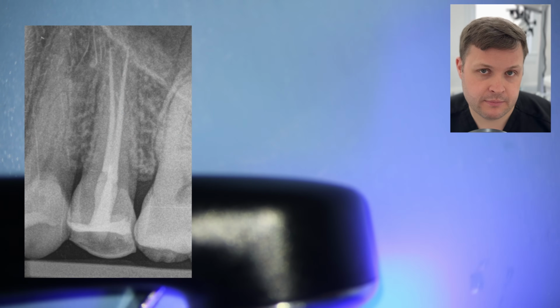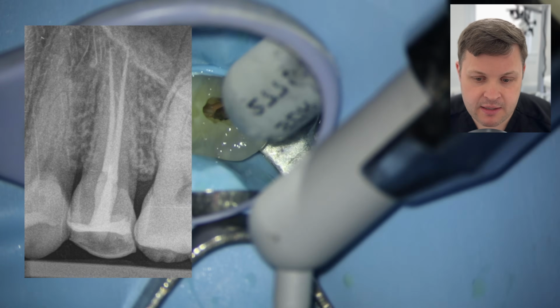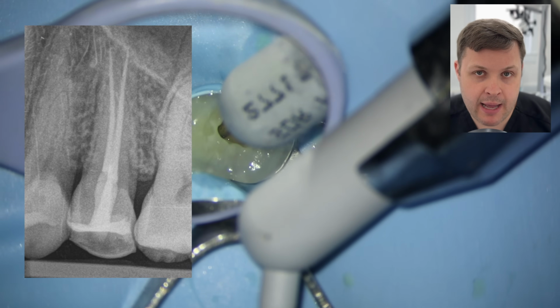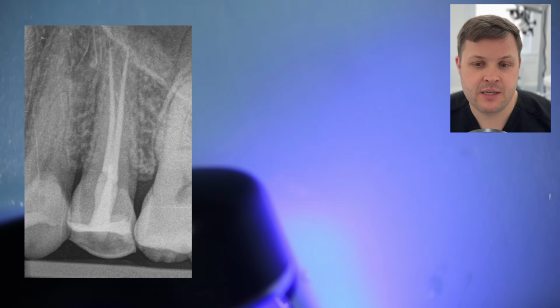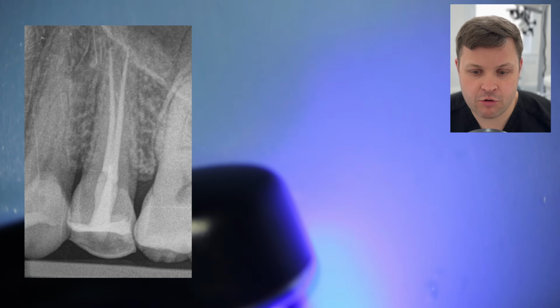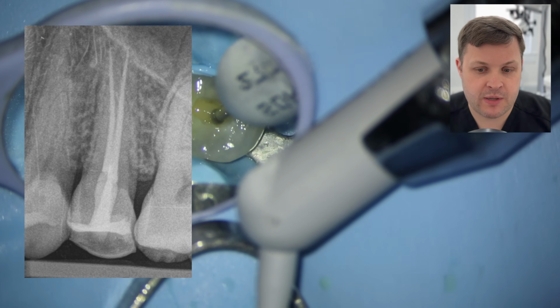It's beautiful. It's always beautiful, but this one's particularly beautiful. I'll tell you why I like this. I think it's got a really nice minimal prep. So we've kept the integrity of the crown as much as possible. I like that we've used a minimal prep.